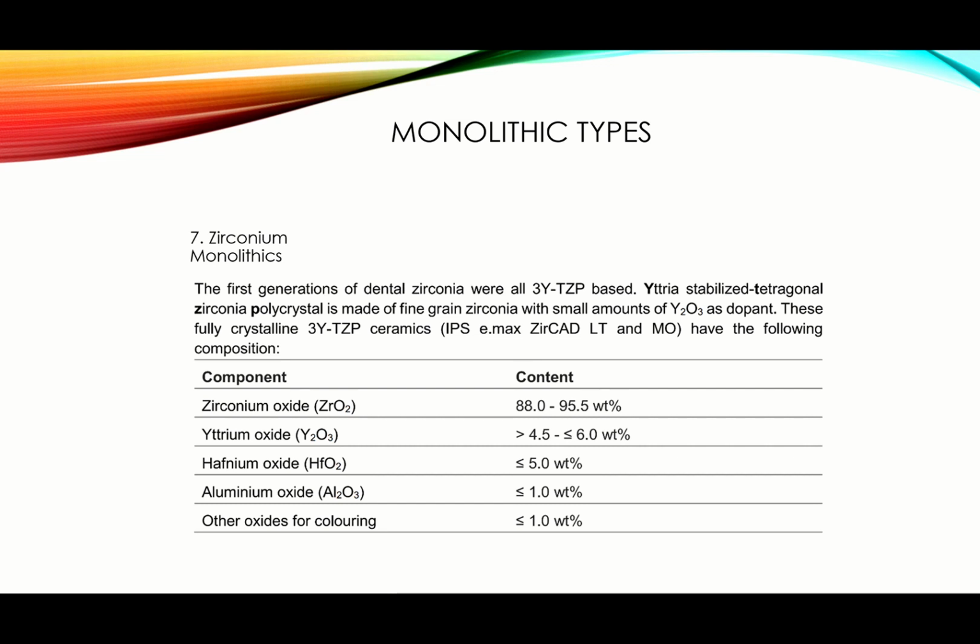How do they play with the content? On a basic level, not very deep, at least you'll have a sixth sense if somebody advertises to you, oh, now we have cubic zirconia, oh, now we have high-content tetragonal zirconia. This is my attempt to help you elevate your knowledge about the zirconia block, so you can at least say, this doesn't make sense, or I need more information, or okay, you give me more translucency, but is it weaker now?